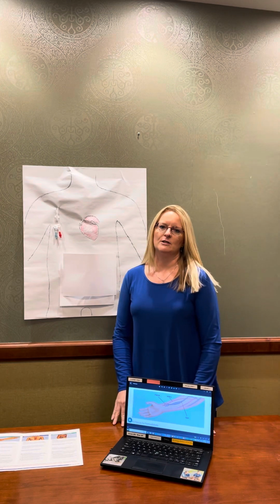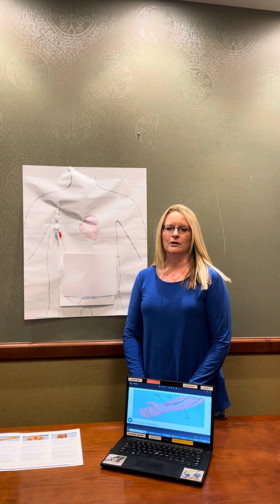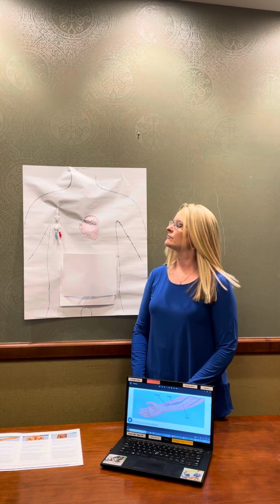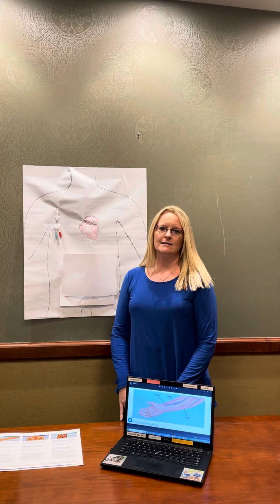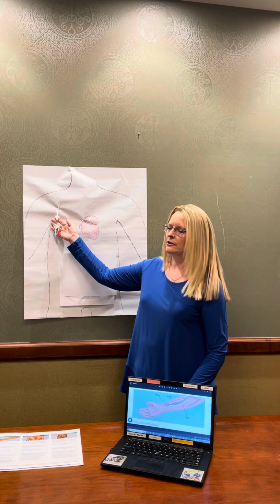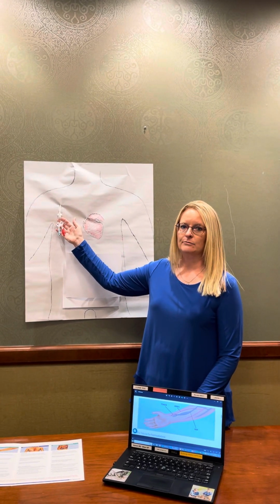Our third option for a dialysis access that uses the bloodstream is our central venous catheter. When your loved one has a central venous catheter, it looks like this. You're going to see this segment outside of their body.